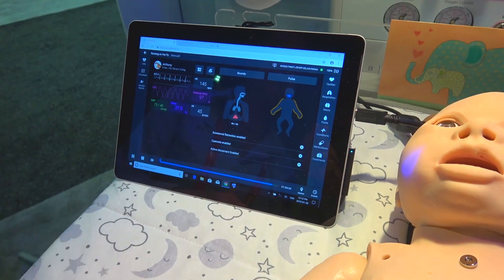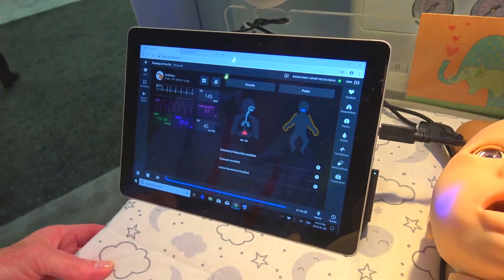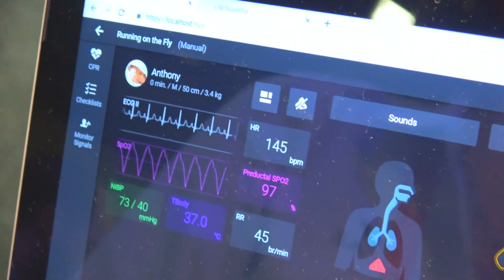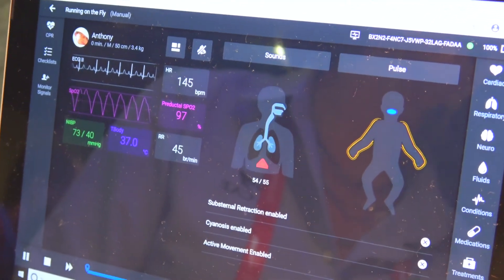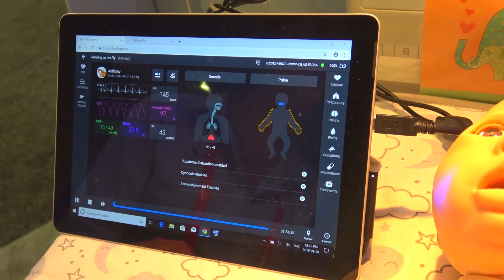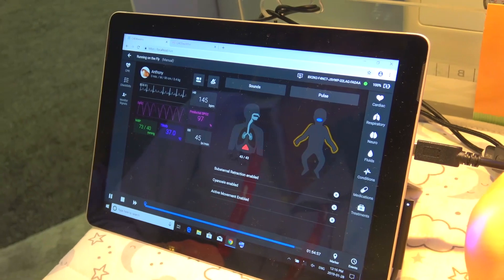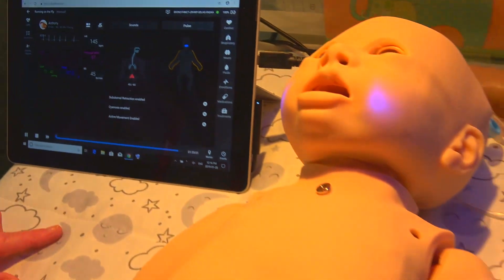Luna runs on our Maestro software, which is our latest software — very user friendly. You can run on the fly or run a pre-programmed scenario. Luna will come with five pre-programmed scenarios that include a newborn resuscitation, a one-month-old code situation in the emergency room, poor perfusion, pneumothorax, and neonatal abstinence syndrome.